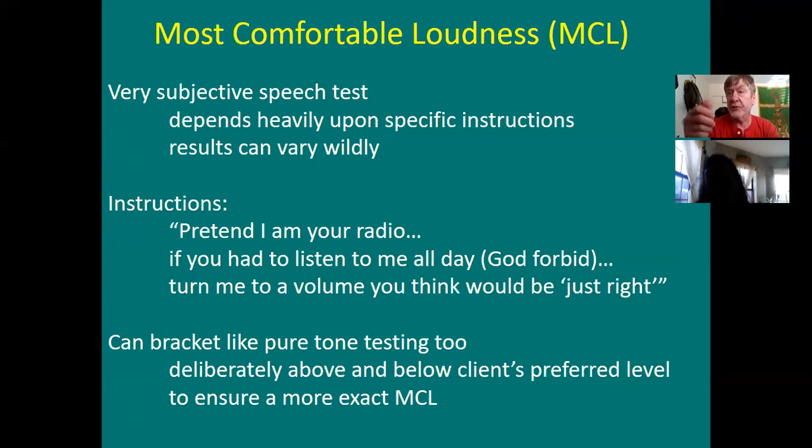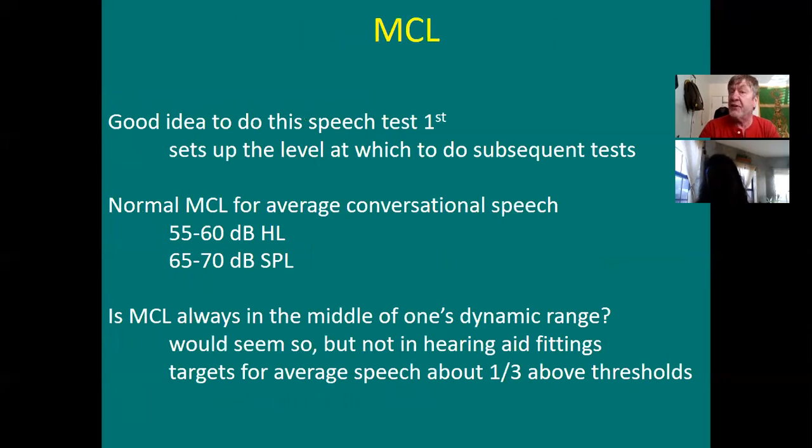Turn me up or you've got the control. You turn me up or down until I sound just right. Anyway, good idea, by the way. This is just FYI for audiometry and for sales of hearing aids. A good idea to do this speech test first, and it sets up the level at which to do later hearing tests.